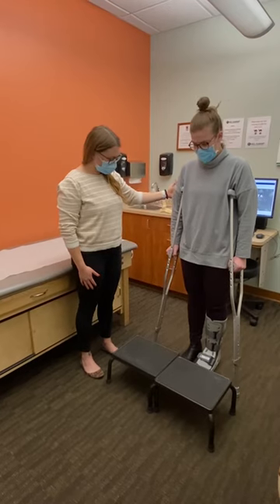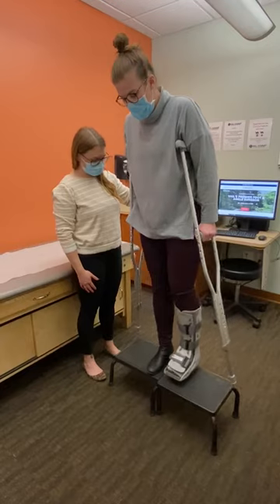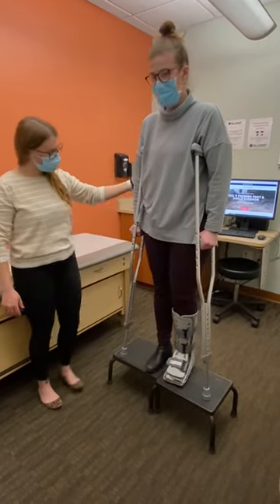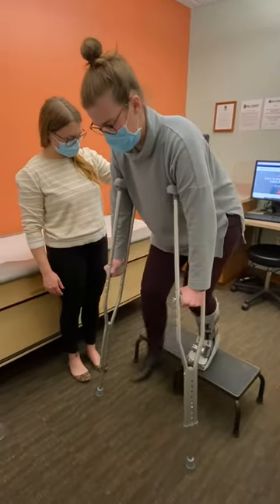When going up the stairs, it is important to lead with your good leg and follow with your crutches. When going downstairs, it is important to lead with your crutches and follow with your good leg.